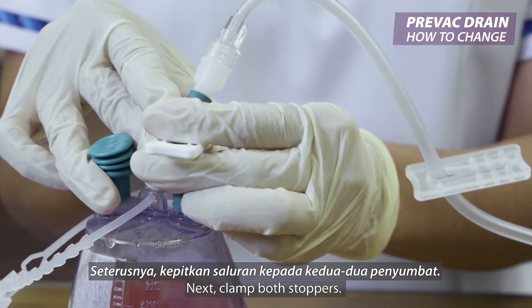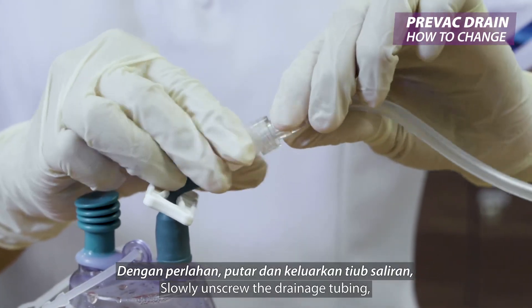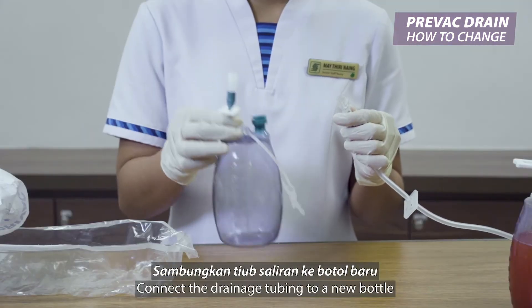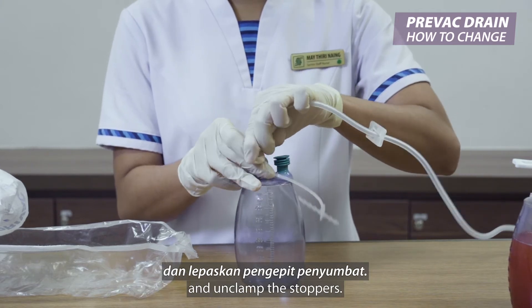Clamp both stoppers. Slowly unscrew the drainage tubing and cleanse with an alcohol swab. Connect the drainage tubing to a new bottle and unclamp the stoppers.